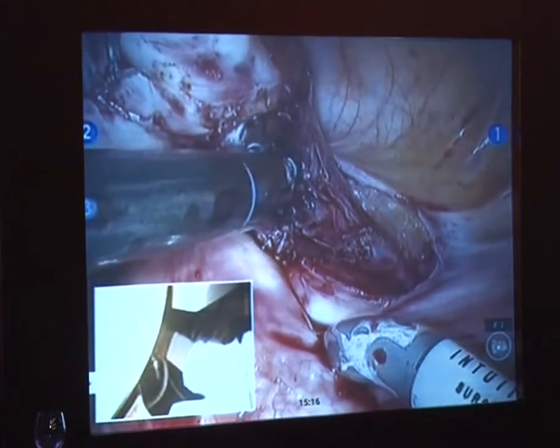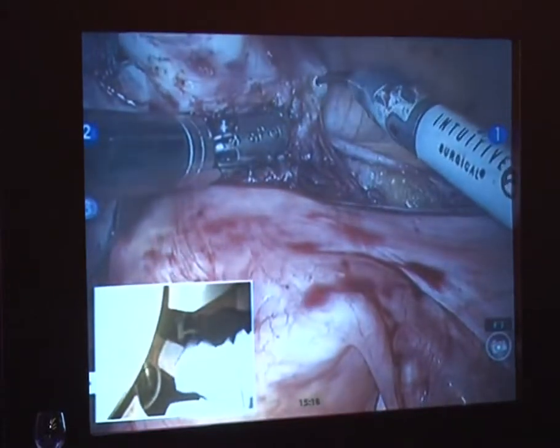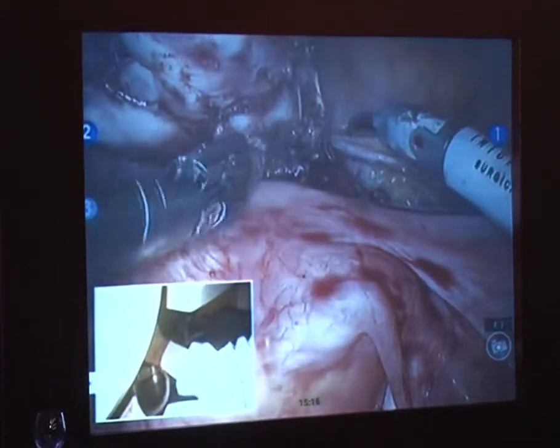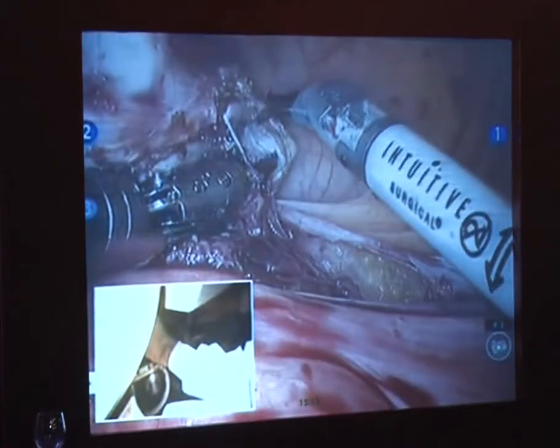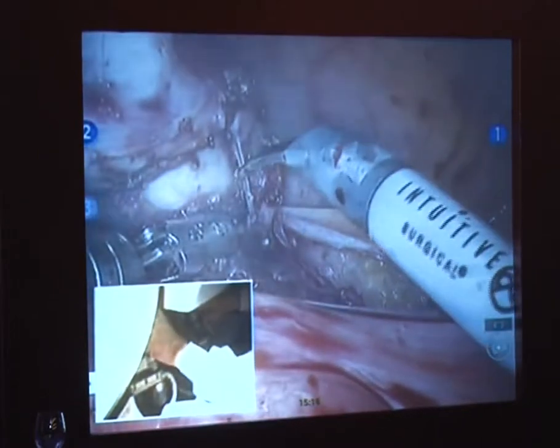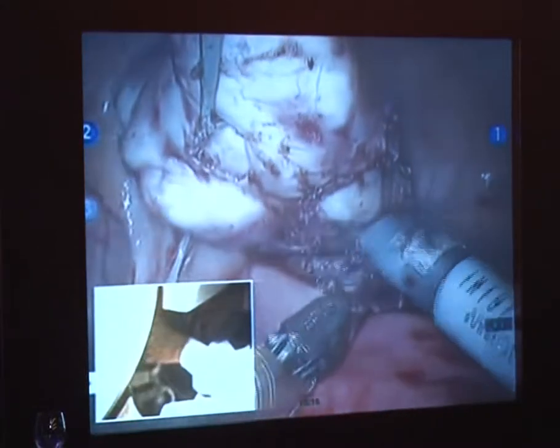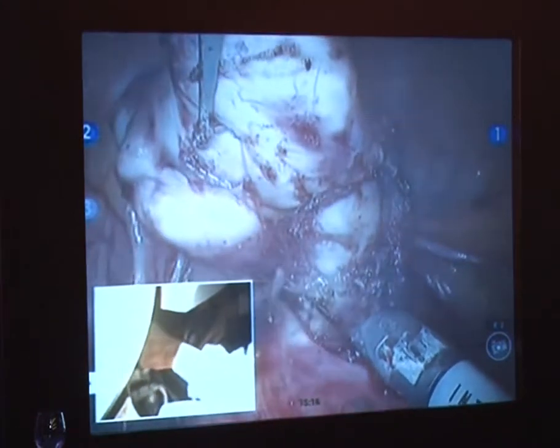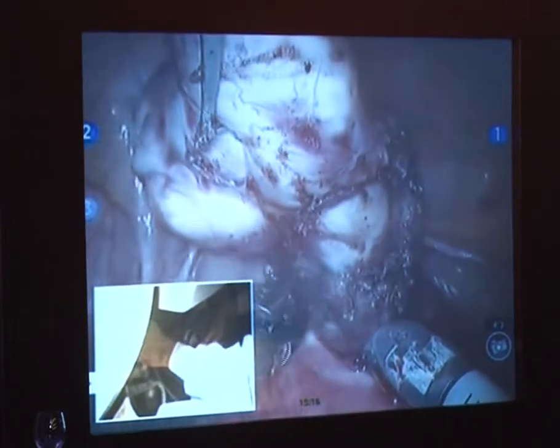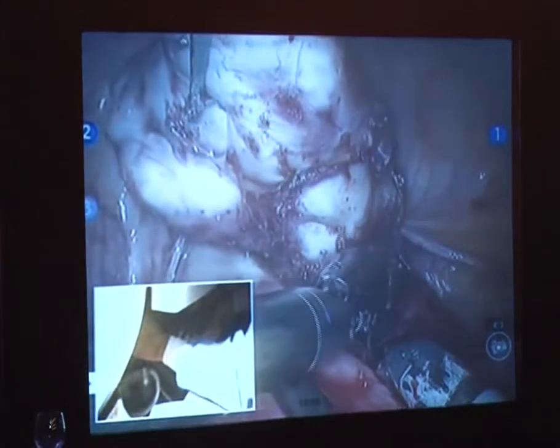I'm just trying to figure out where I'm getting to where it's attached to the uterus. I need to figure out where I need to cleave this off at some point. Can you suction in here? Or it's the uterus here, so it's good right there. This is a little bit vascular right here. And sometimes in situations like this, it's always better to leave a little bit of myoma on the uterus, on the bed itself, than to try to get greedy and think you're going to take everything and pop it in.